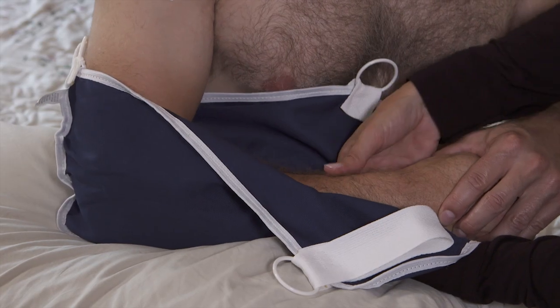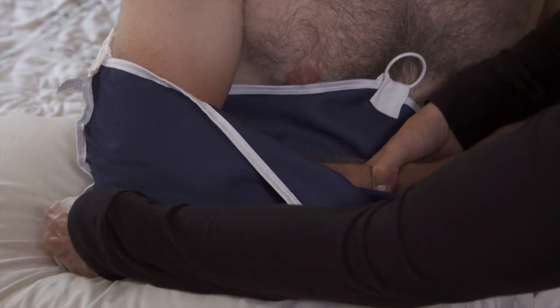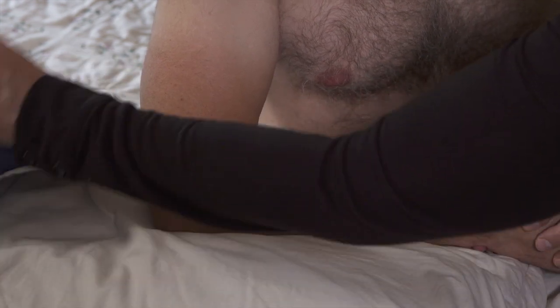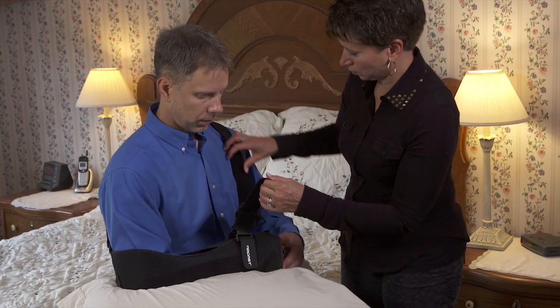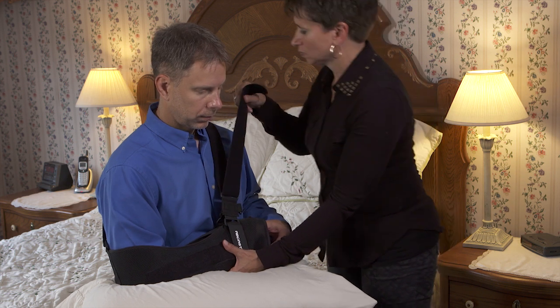Your helper reaches inside the sling to hold your wrist. You may hold your wrist or hand to help keep your arm from moving, while he or she gradually pulls the sling off your arm toward your elbow. Do not move your healing shoulder or your arm. Let your helper do the work. Your helper puts your shirt and shoulder sling on, as instructed by your healthcare team.